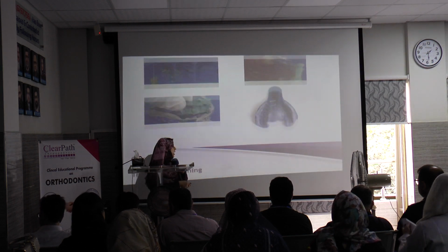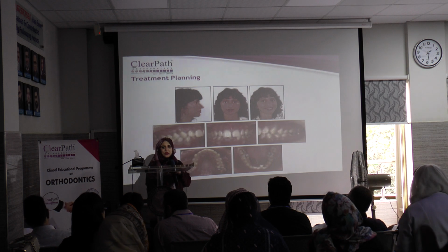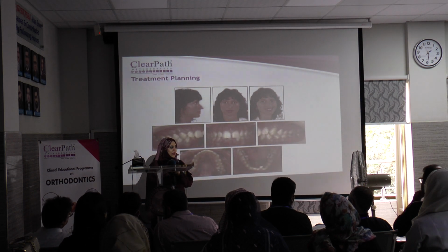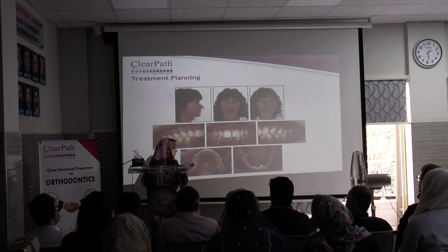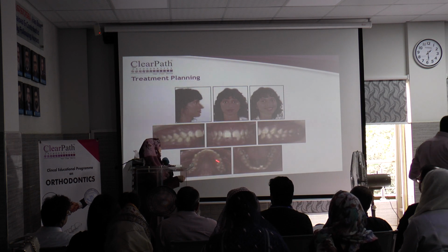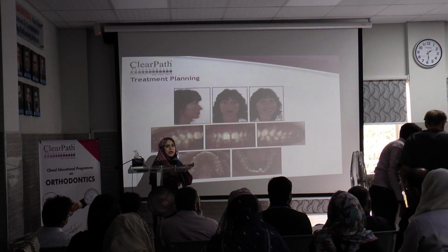Okay. Now, the treatment planning part. Yes. Upper 4-4 expansion. Upper 4-4 expansion and lateral line. Okay, anybody else? Diastema closure. Posterior expansion of the region. And lower? Non-extraction. Exactly. Basically, a slight arch expansion in the upper arch and IPR in the lower arch.